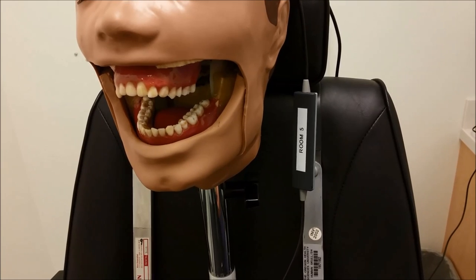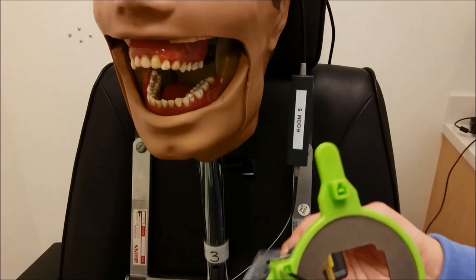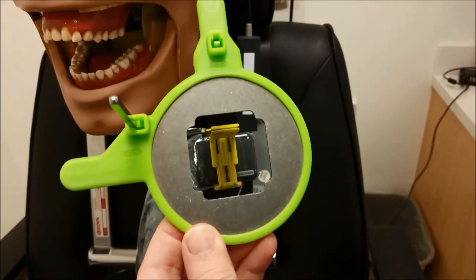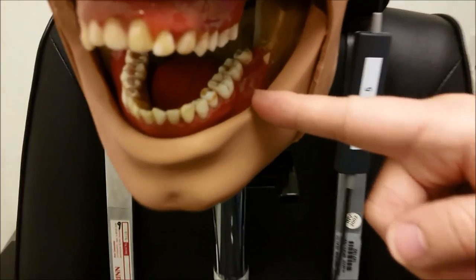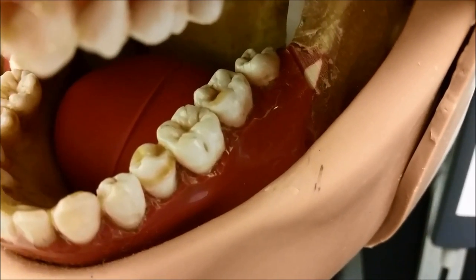Now we're going to be moving to the mandibular molar periapical. We're going to stick with the same setup as we did with the mandibular premolar periapical, and we're going to mainly aim for the contact between the first and second molars.